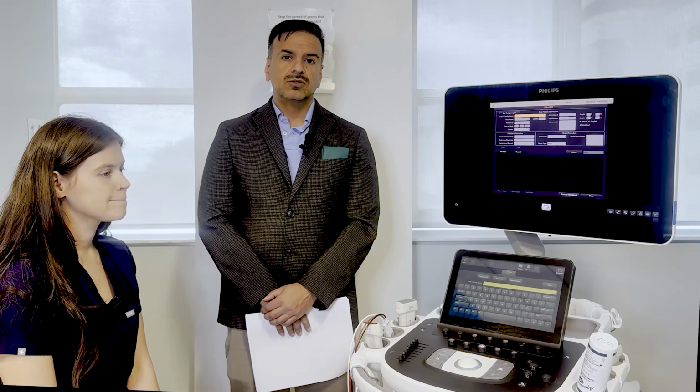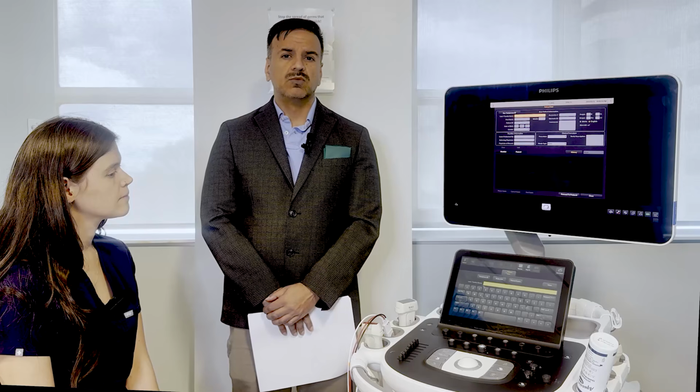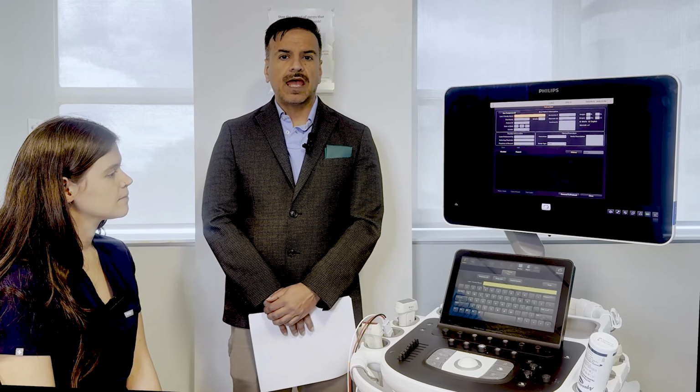The purpose is to talk through some of the acquisition principles and some of the measurements. Not all labs are doing all of these measurements, but it's good to think about which ones you may want to incorporate in your lab, which ones you're already doing, and which ones you may want to practice a little bit more. Let's get started.